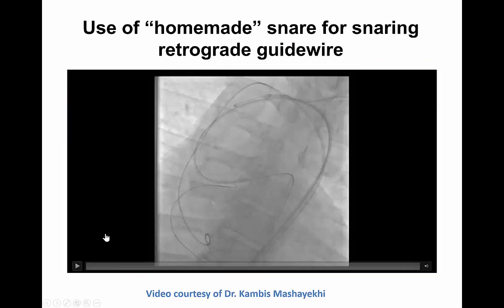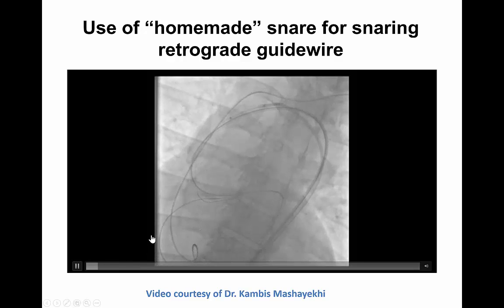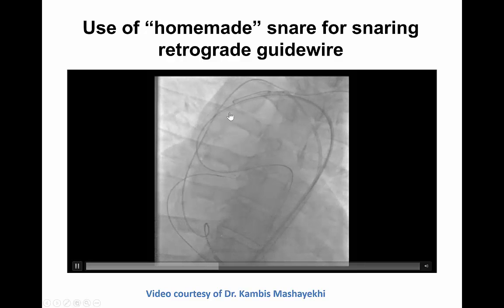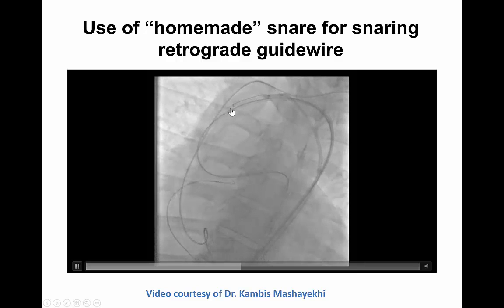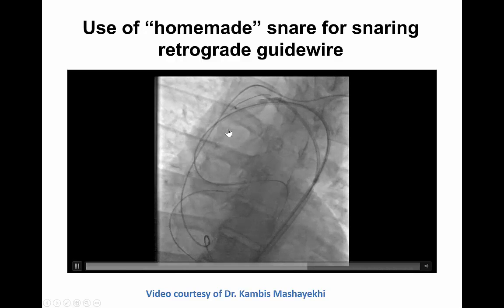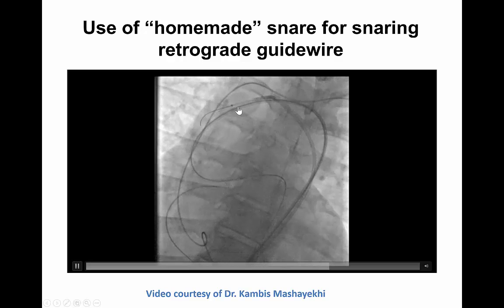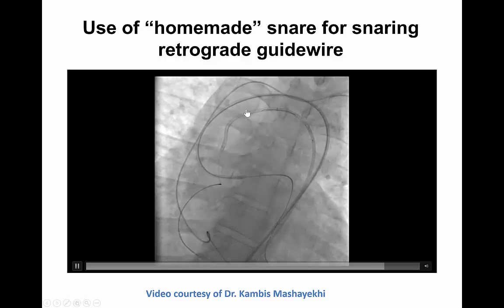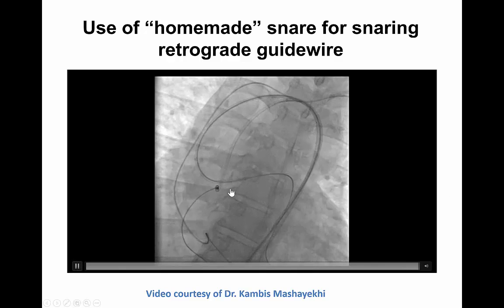This is an example using this homemade snare for snaring a retrograde guide wire during a retrograde CTO-PCI. This is the guide catheter extension with the inflated balloon, and the loop of the guide wire. This is the retrograde guide wire that is advanced through the loop of the homemade snare. Then the wire end is pulled back, which essentially snares the retrograde guide wire into the antegrade guide catheter, and then externalization can be completed.